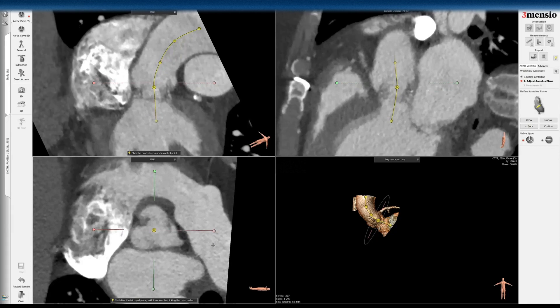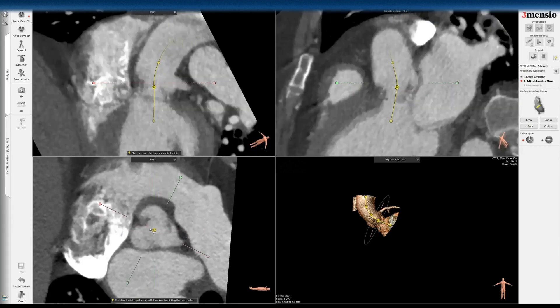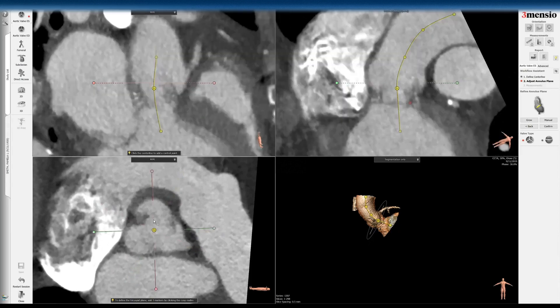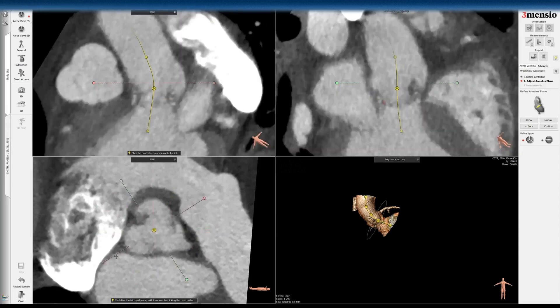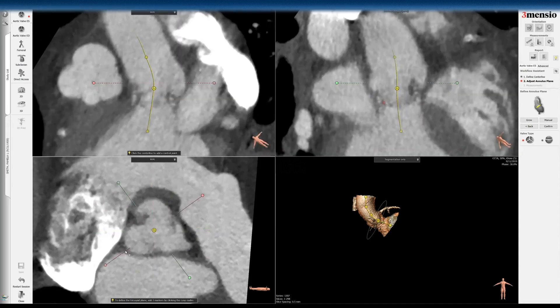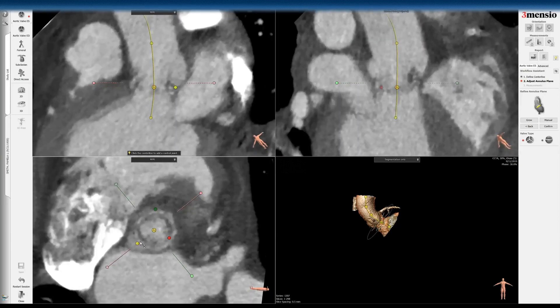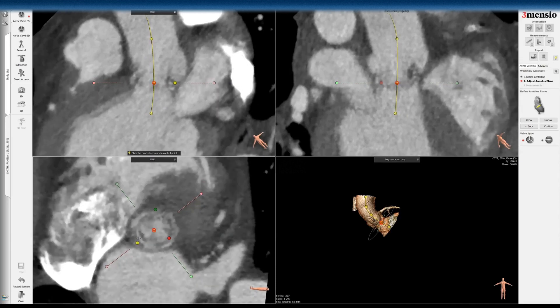You start with the open red circle to bisect the commissure, and then you put a dot at the bottom on the top-left panel. Then you try to do the same thing, bisecting the right sinus and putting a dot at the base of the right. And then you do the same thing, rotating counterclockwise and doing it in the non-coronary. So now you have roughly an annular plane to work with.